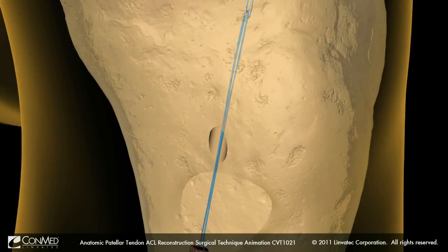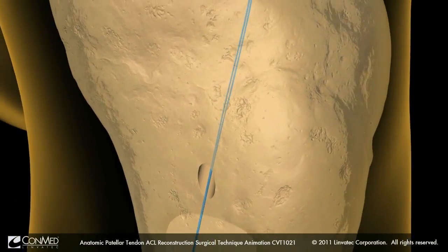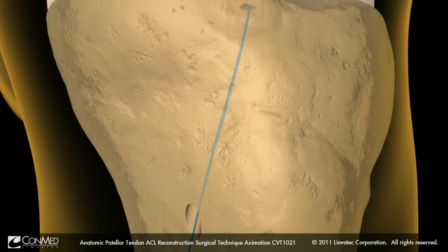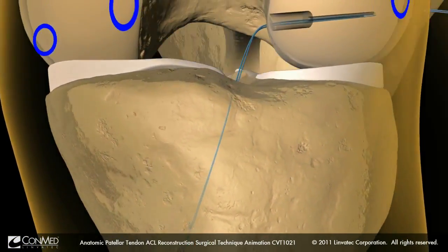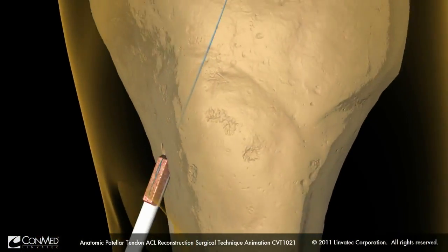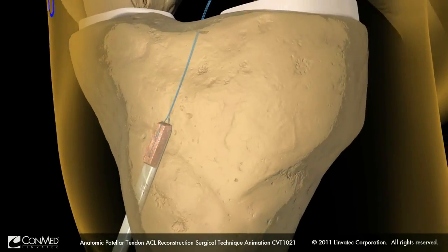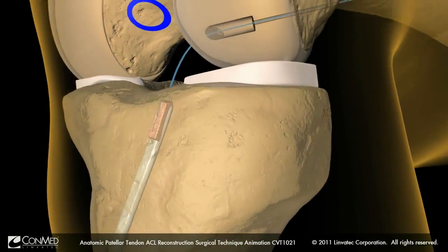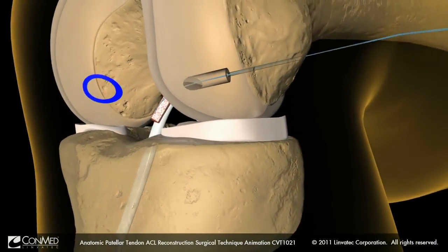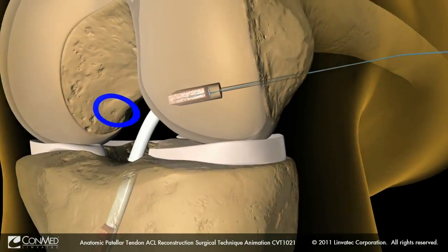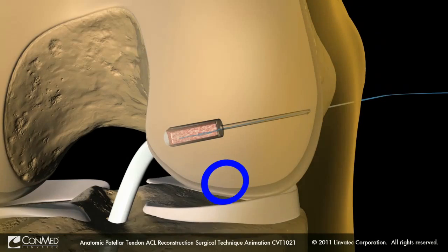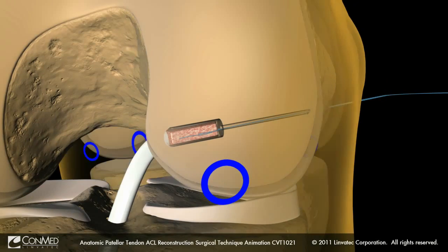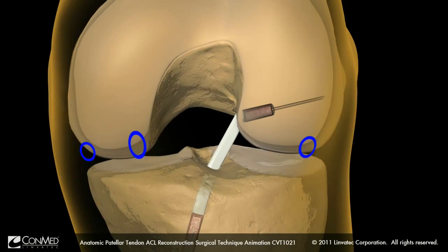Load the suture limbs of the bone patellar tendon bone graft into the passing suture loop. Pull the BTB graft into the joint while hyperflexing and elevating the knee to ease graft passage.